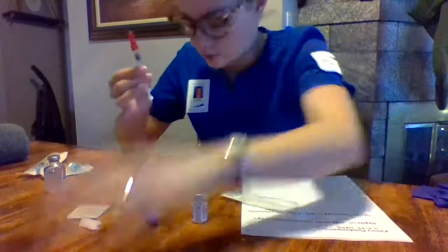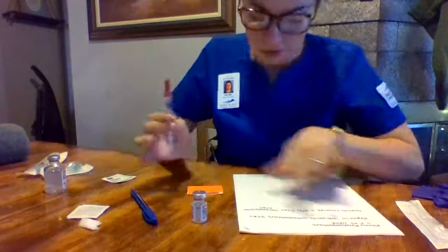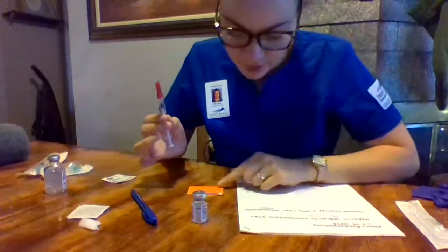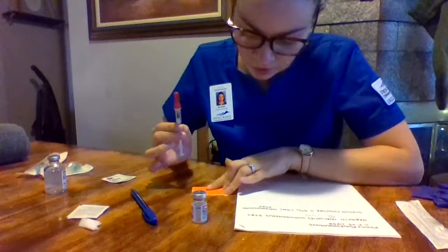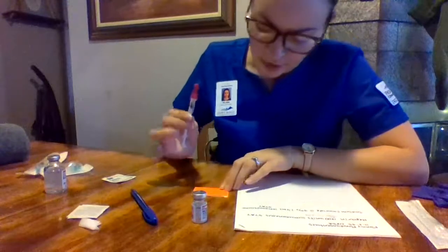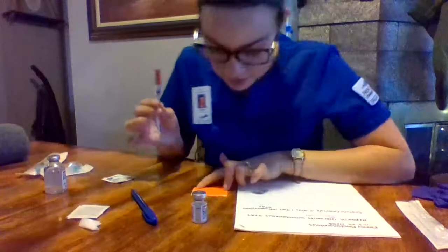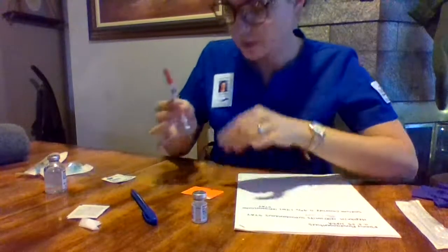And then check my label, my MAR, and my syringe. So I have Fanny Fundamentals 11355, heparin 1200 units, 0.12 milliliters subcutaneously, added by me on 11/16/20 at 1 p.m. And this is not expired.